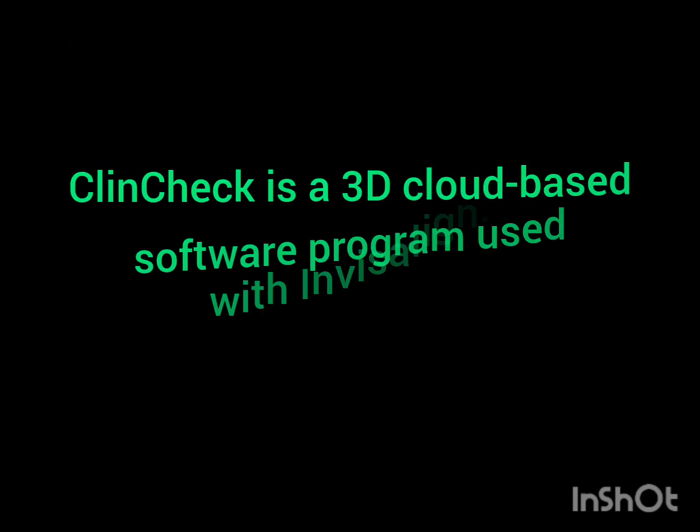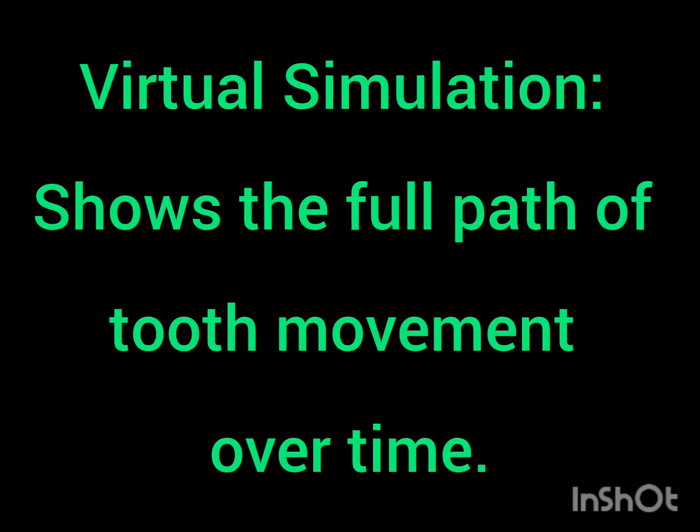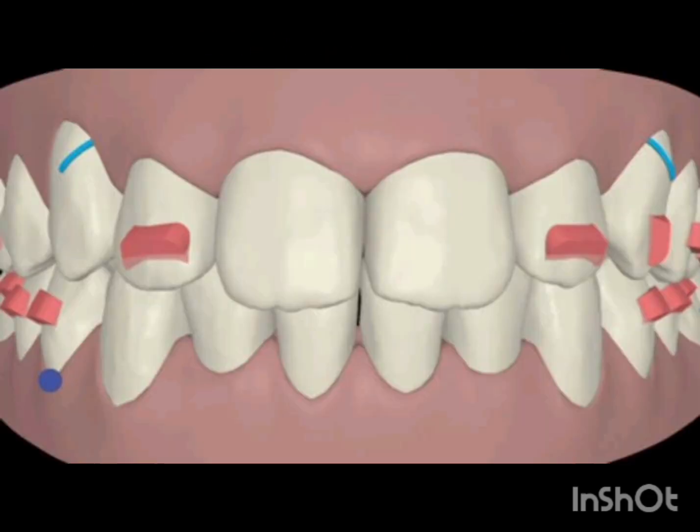Hello everyone. In this lecture, we will be learning about ClinCheck style treatment planning, one of the most important steps in clear aligner therapy. A successful aligner case does not begin with the first aligner. It begins with a well-designed digital treatment plan, and this digital setup determines how much each tooth will move, where attachments will be placed, whether interproximal reduction is required, and what the final occlusion will be like.